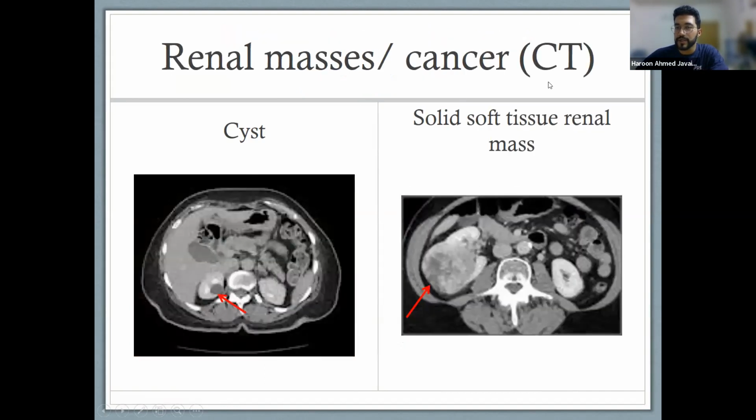For diagnosis, what we're going to use is CT. Now, as a rule of thumb, whenever we are suspecting a cancer, we're most likely going to use contrast. Why? Because the contrast is injected into the blood. We know that the cancer cells are going to uptake the blood because they're using a lot of oxygen. So when we see it under the scan, we're going to see the pathology light up. And if it lights up, we know that this is most probably cancer. Okay, that's why they inject contrast.